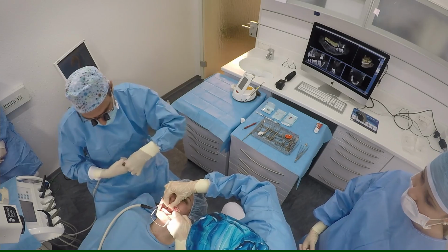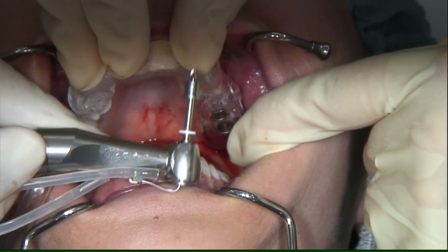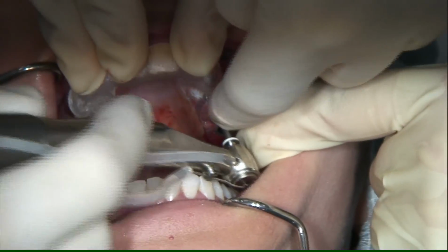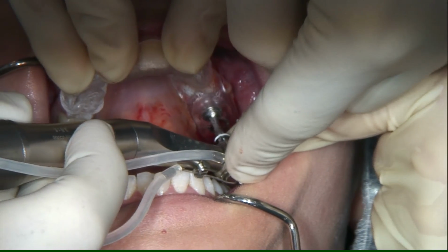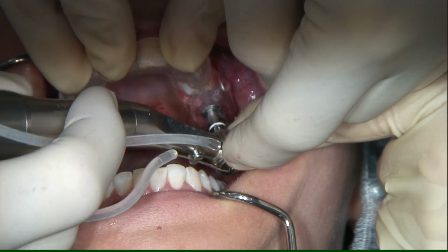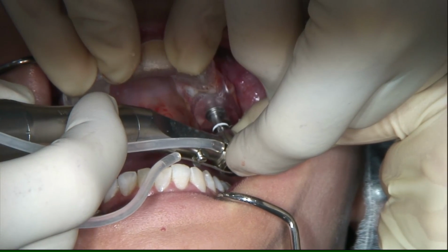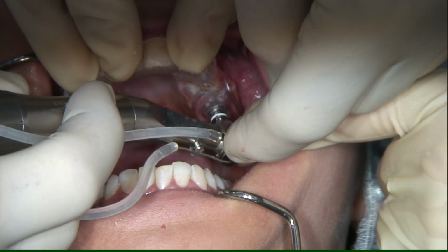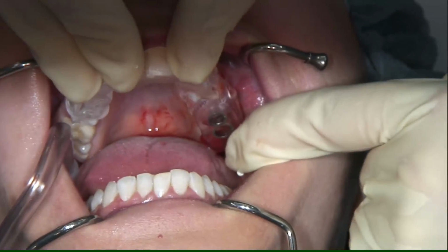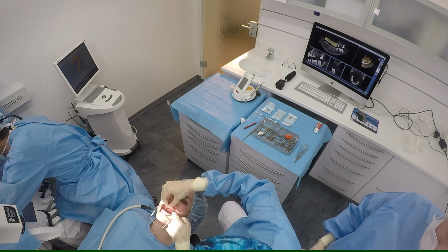Now we switch to the pilot drill. After center punching, we switch to the pilot drilling. Diameter 2 millimeters now. So I remind you, the full diameter we planned was a 3.8 millimeter Xive S implant. So first center punch and then pilot drill with the 8 millimeter burr. The planned diameter is 3.8 and the length of the implant is planned 11 millimeters.